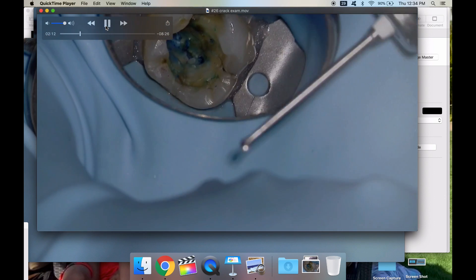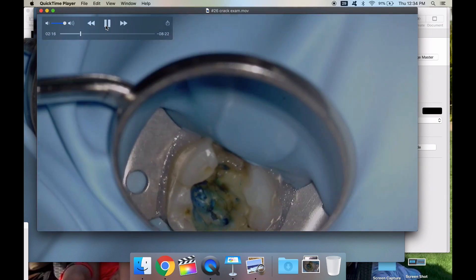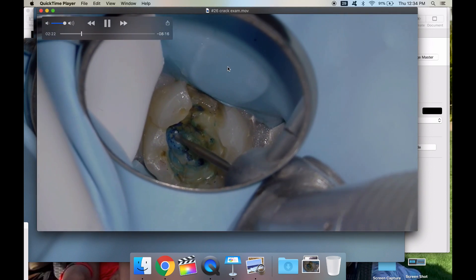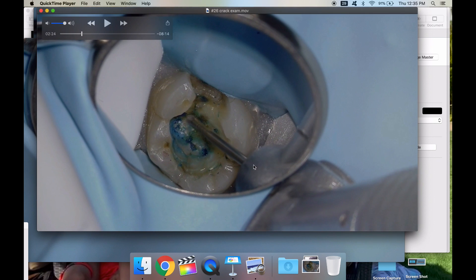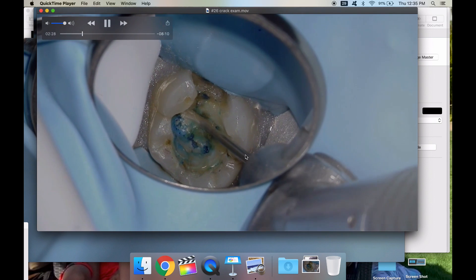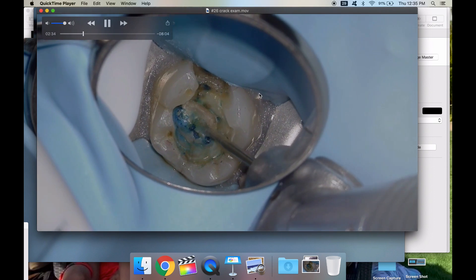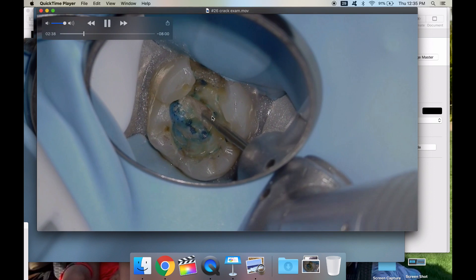I'm going to use the Month's burr — it's a really amazing tool. It's essentially a number one round burr in surgical length but with a really long shank, which allows me to keep the head of the handpiece out of the way. I'm going to trough from the mesiobuccal cusp to the palate along where that dark piece was — that's really where the pulp chamber is — and you can start to see the pulp horn pop out.